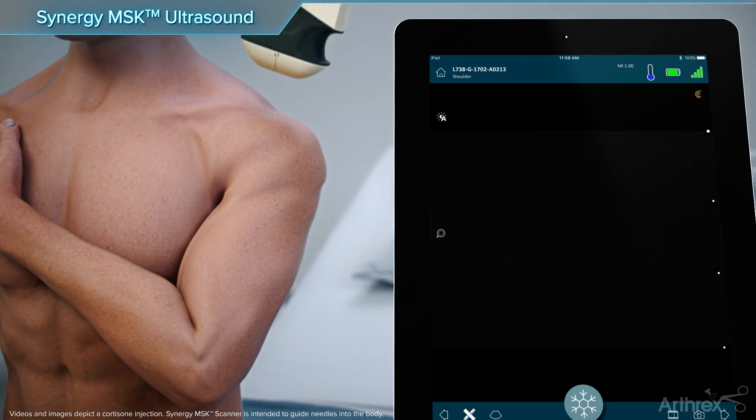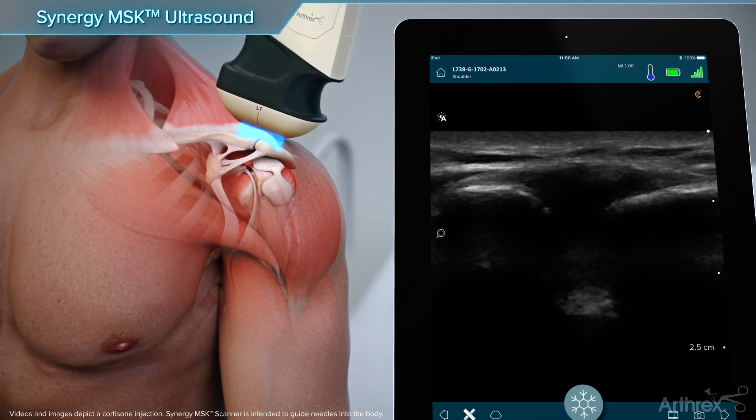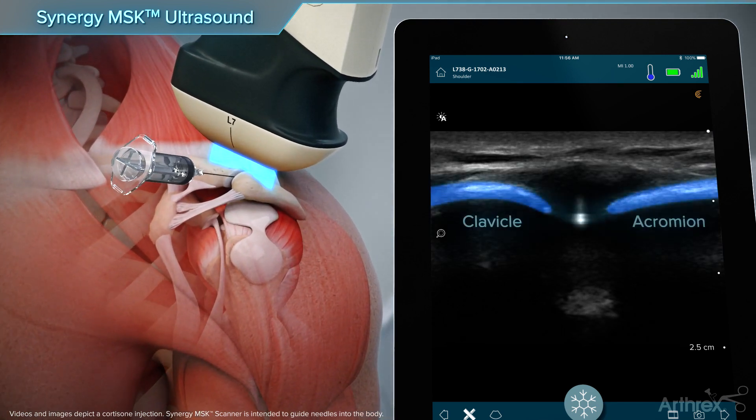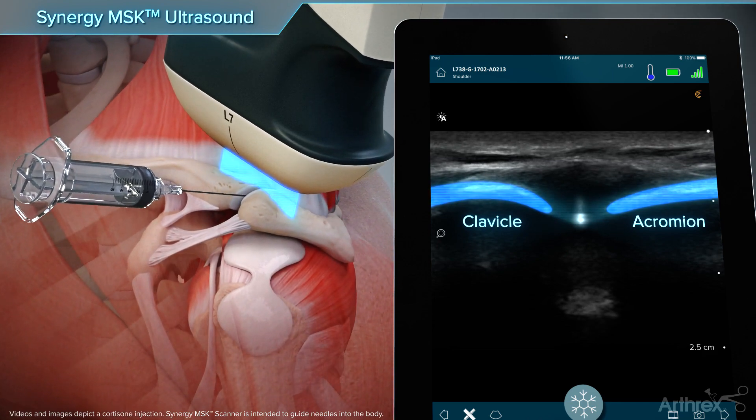To visualize the acromioclavicular joint, move the arm back into a neutral position and place the scanner over the acromion in the coronal plane. From an anterior direction, direct the needle out of plane with the scanner into the AC joint.